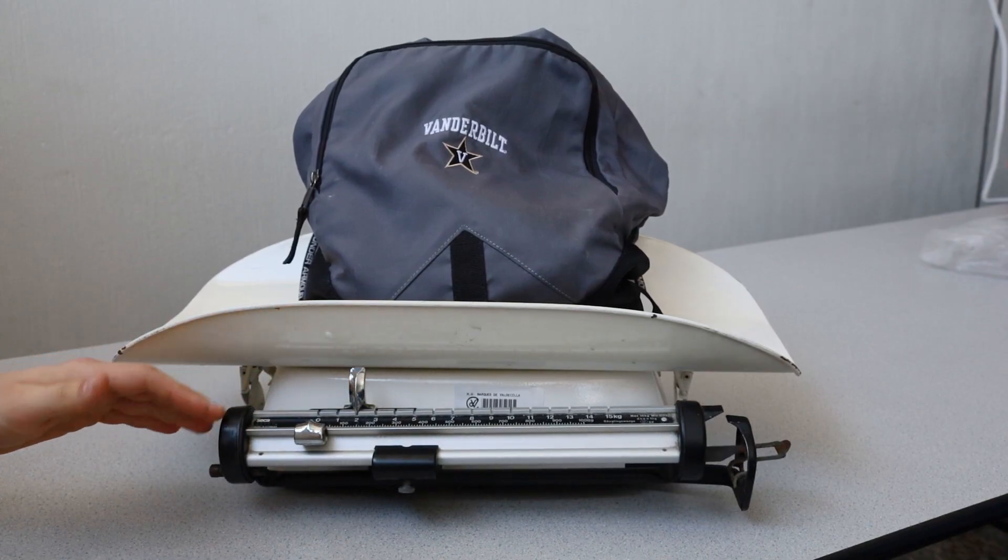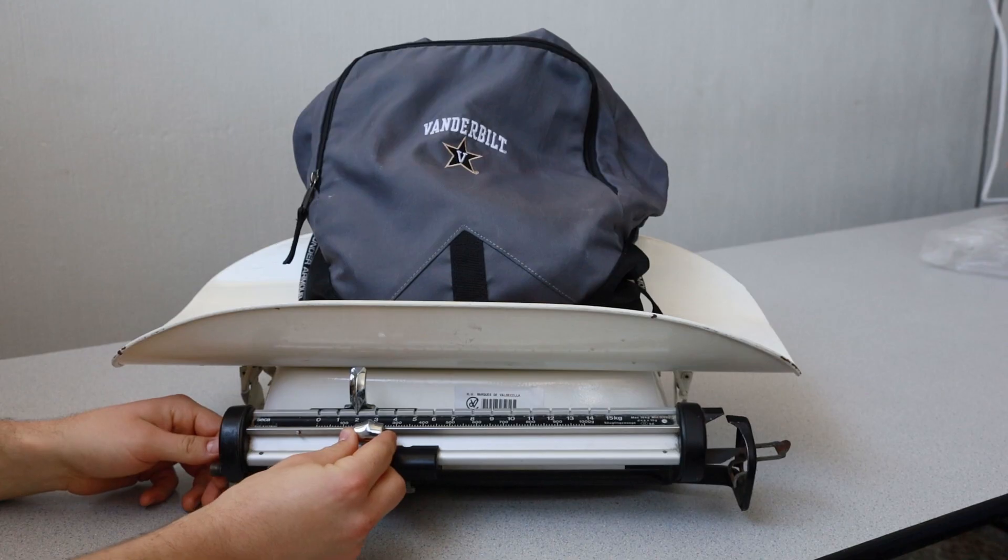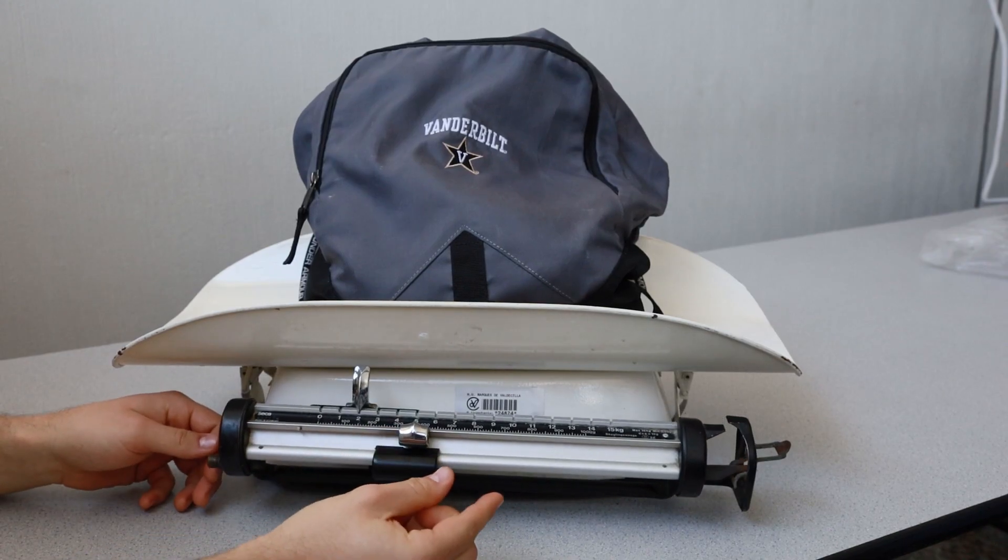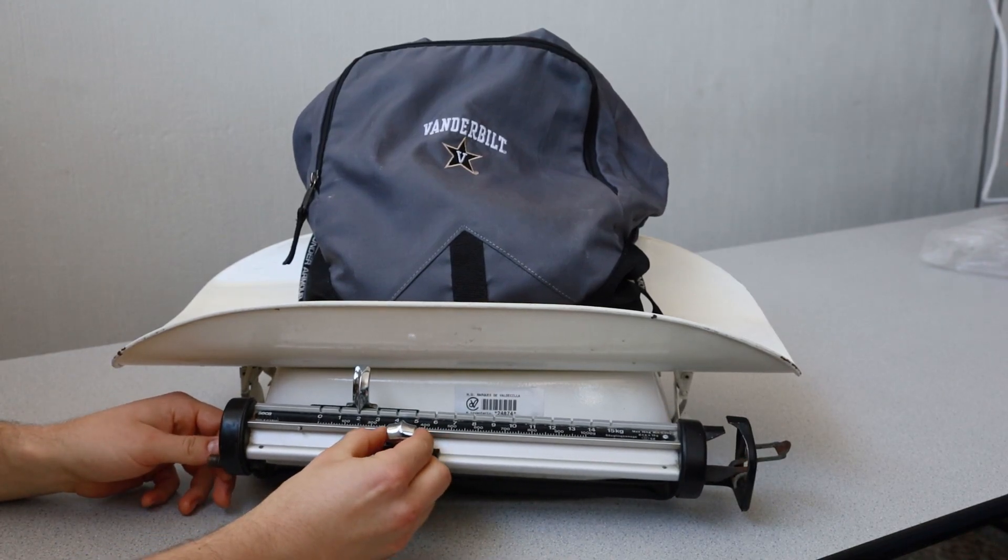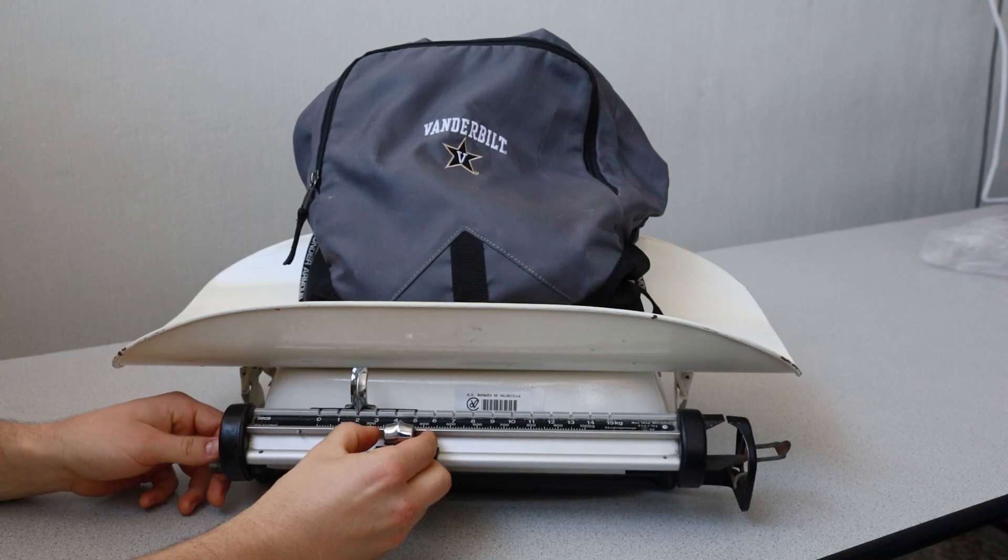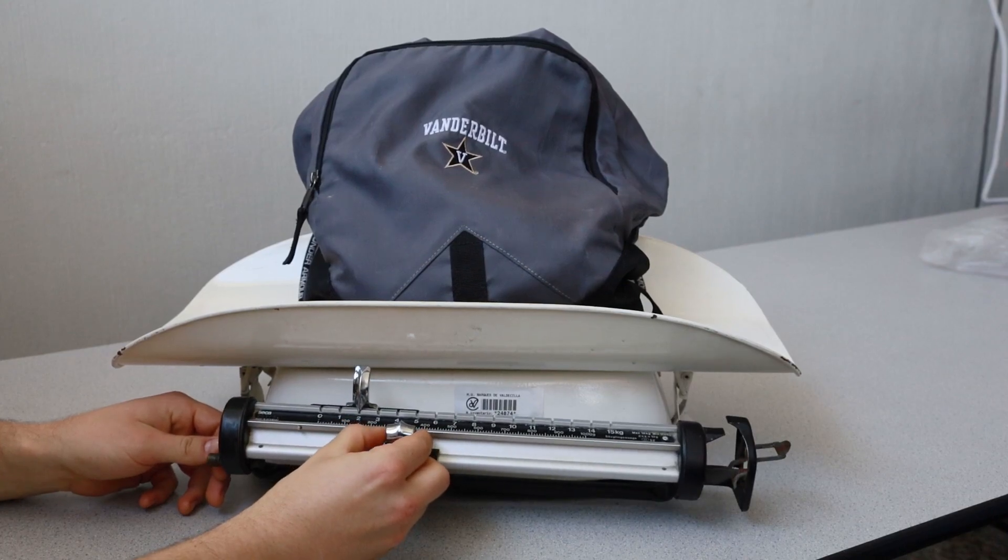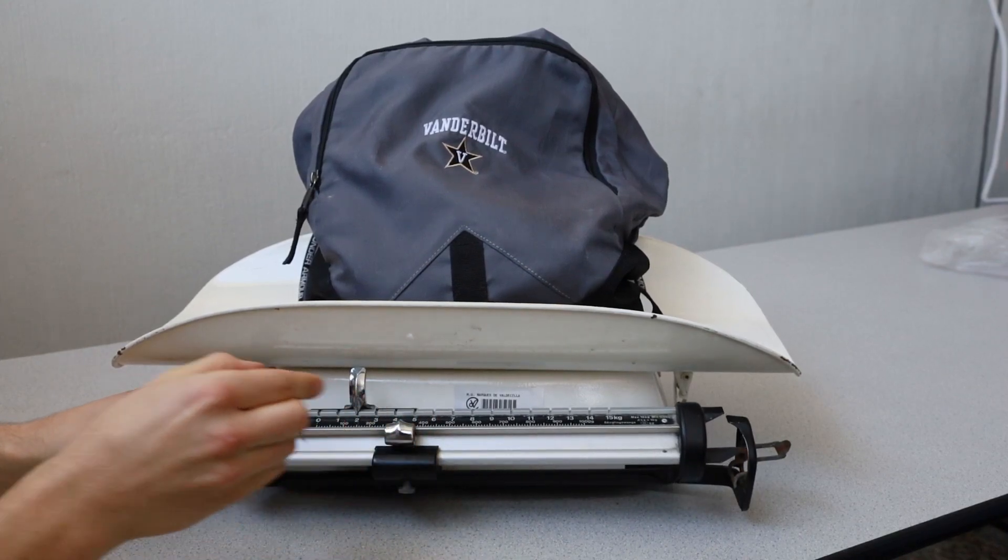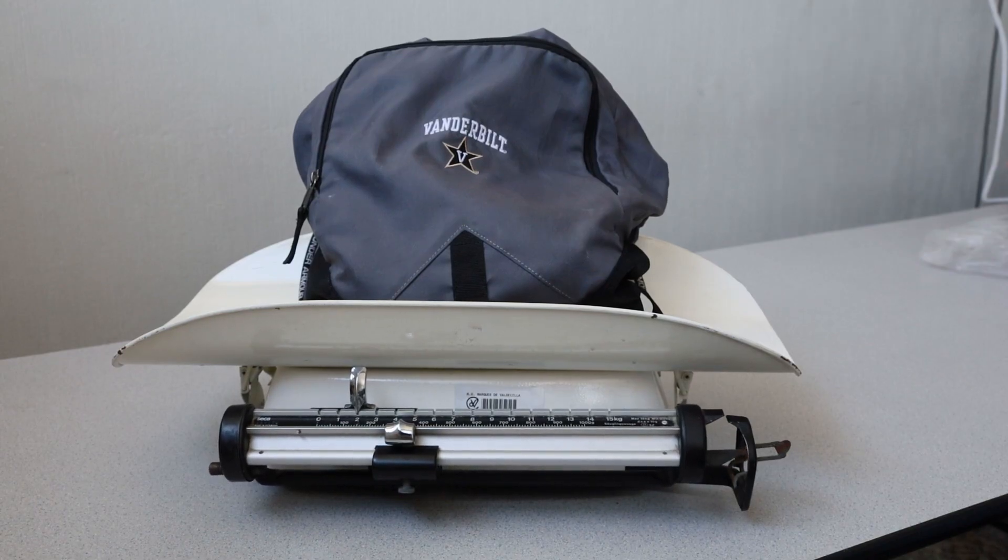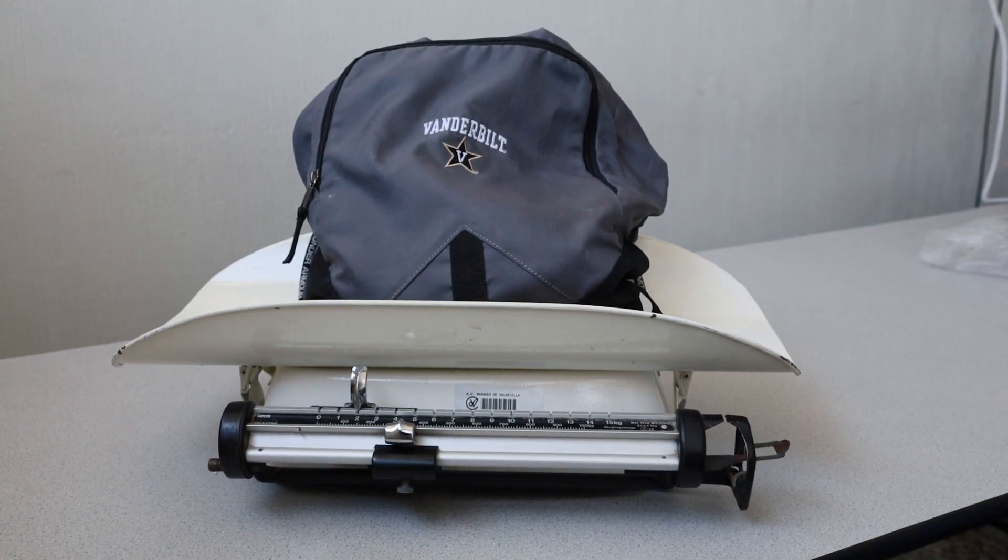Next, slowly move the small sliding weight to higher slots. Notice how the beam balance begins to slowly level out. Continue moving the small sliding weight until the beam balance is fully level and stays level. The weight of the unknown object can now be determined as the sum of the numbers that both the large and the small weight have been placed at.